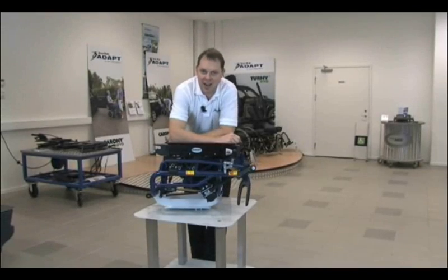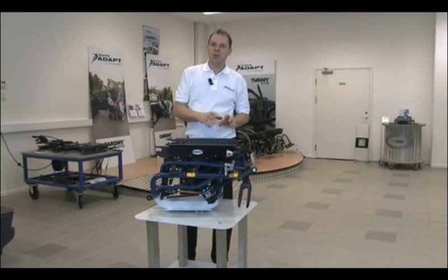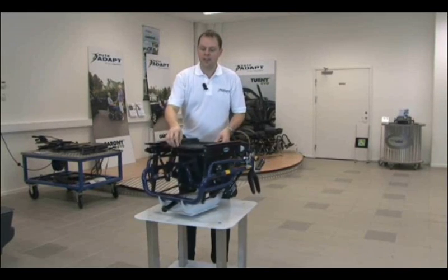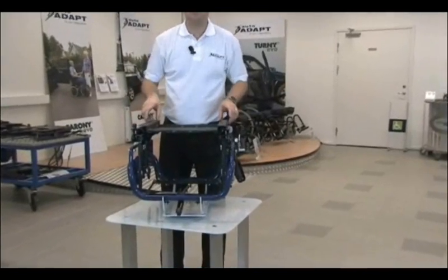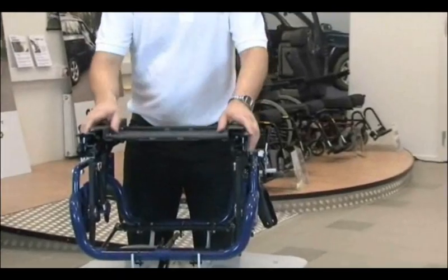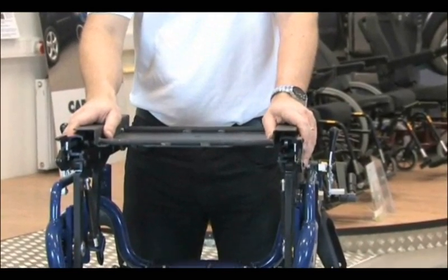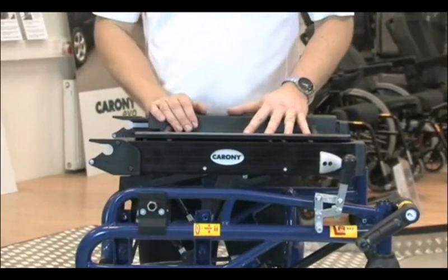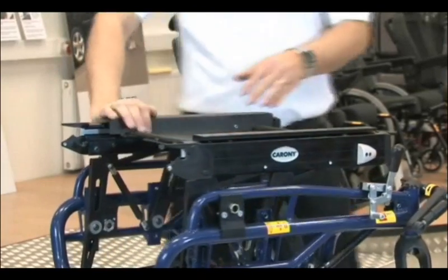Let's take a look now at the Carony as it is when you have a seat on it. You have to imagine the seat here, because I have installed the seat carrier, the Carony carriage, into the Carony rails. So now it's stuck, so to speak. If you need to disengage or take away the seat from the Carony wheelchair, I will now show you how to do that the easiest way.